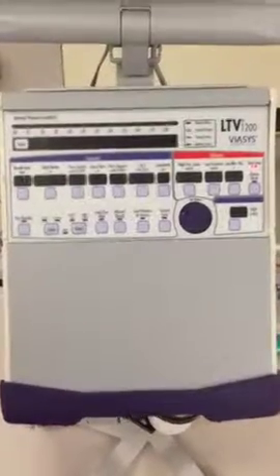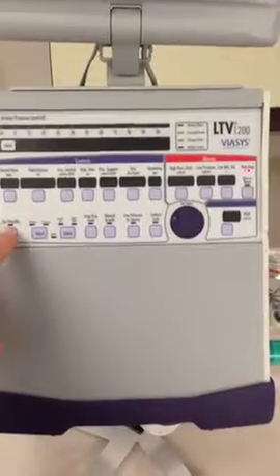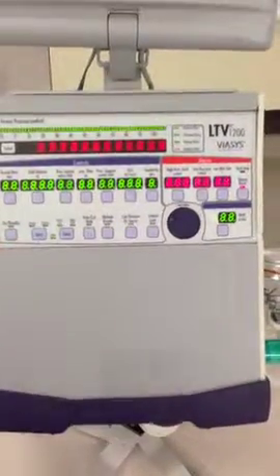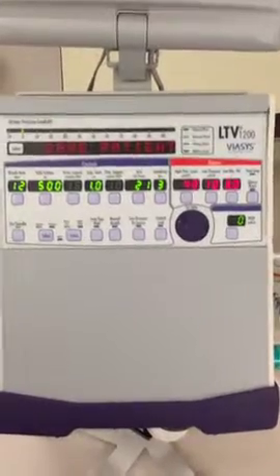So let's go ahead and turn on this LTV. In the bottom left corner here, you're going to see a hard key button that says on standby. I'm going to select that. You're going to see the LEDs all light up and an audible alarm.